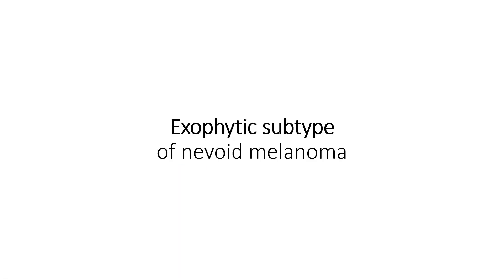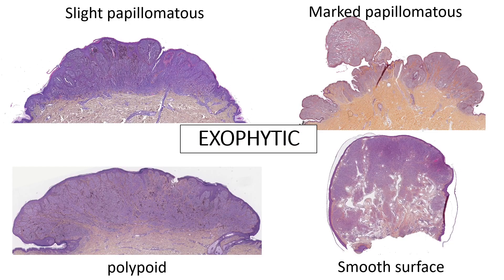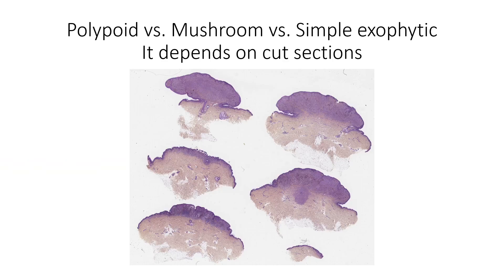Starting with the exophytic architecture at low power, it's not always papillomatous — it can be either slight or really marked. We can also have polypoid or smooth surface lesions. There's often an extension along the hair follicle that gives the lesion a mushroom shape. Here are some examples, and basically it depends on the sections — some areas will look more exophytic or mushroom-shaped.